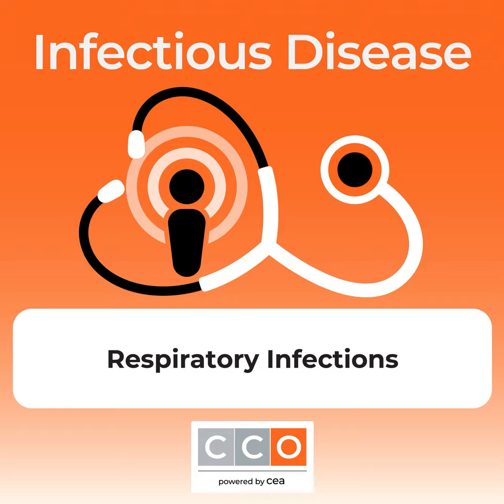Moreover, with the semi-quantitative panels, you may get a lot of positive results on the BioFire pneumonia panel, and then you don't grow the organism in culture. And so this can create a clinical dilemma that you should be aware of. And so, for example, this is a study, this is actually data that combined the data that were submitted for FDA approval for this assay. And of all the specimens where you got a given result on the pneumonia panel, how often did you grow 10 to the fourth CFU per ml of the bacteria in the culture? And so if you had less than 10 to the fourth or not detected, essentially you never grew that organism at 10 to the fourth CFU per ml in culture.